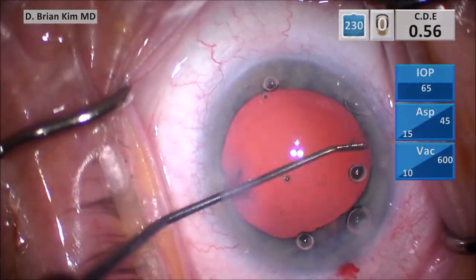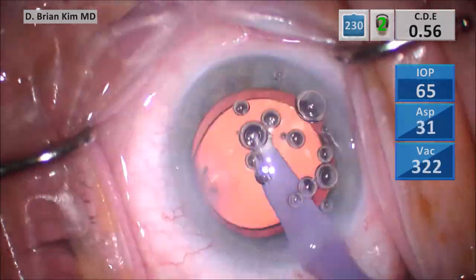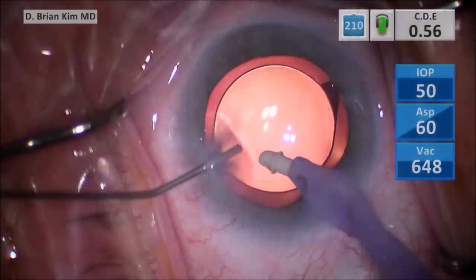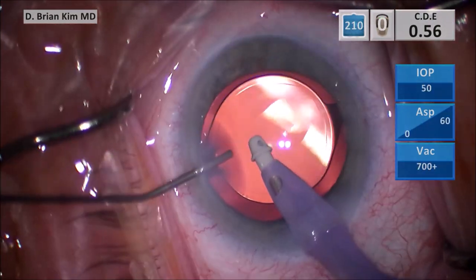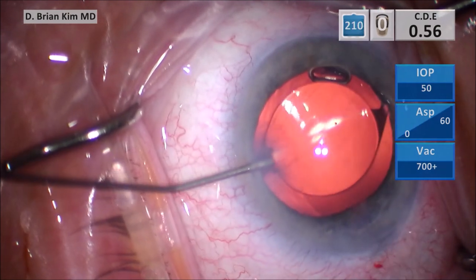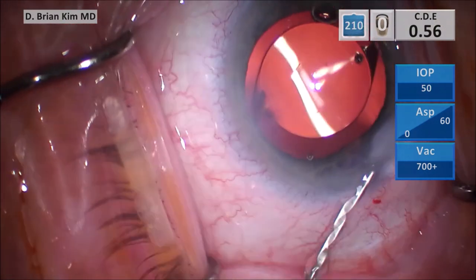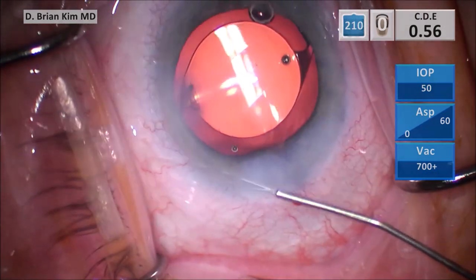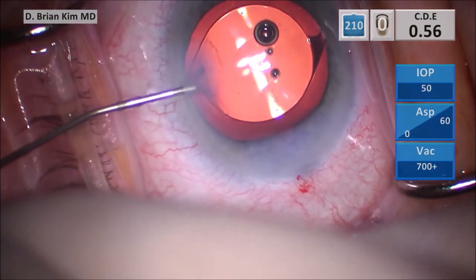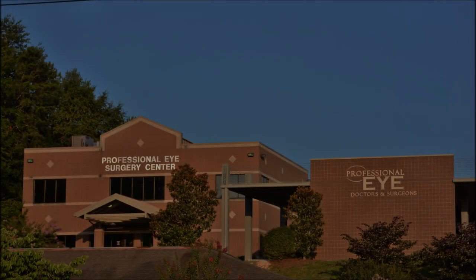I fill the eye with OVD and start polishing the anterior capsular surface on the left side and then the right side. I go ahead and inject the IOL and then clean out the rest of the viscoelastic. For the final step of removing the INA handpiece before hydrating my incisions, I make sure I stop irrigation and gently come out of the eye with the INA handpiece, decompressing the anterior chamber and trying to equilibrate the intracameral pressure to the external pressure. As I do so, the iris does not come to the wound, and then I'm able to hydrate my incisions. Because of these movements and having a good-sized incision, I was able to do this case fairly uneventfully without a lot of iris prolapse to the wound. You can see the iris has not been traumatized too much. I hope this was helpful — thank you for your attention.